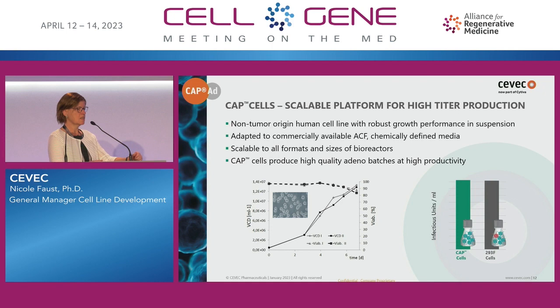And in this case, there is no cell line development involved because that cell is already the producer cell. So all you need to do is take GMP vials from these cells and infect them with your adenovirus, or do a transfection or rescue of the adenoviral plasmid to generate a new safe adenovirus.